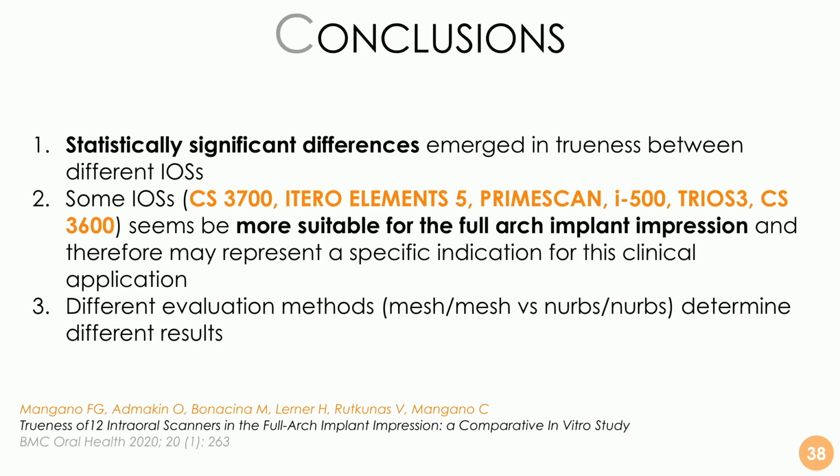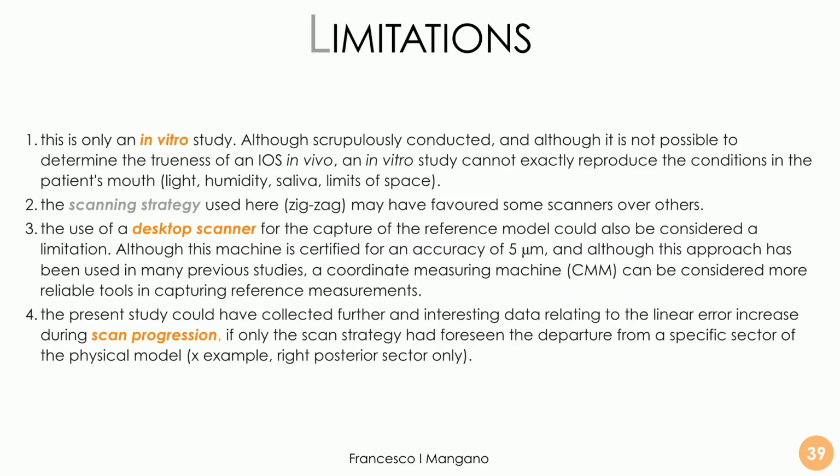Obviously, different evaluation methods determine different results, and there are also intrinsic limits in this study. It's an in vitro study, but of course we cannot perform any in vivo study for the trueness, because it's quite tricky to introduce a reference object inside the mouth. Maybe the scanning strategy used here may have favored some scanners over the others. The use of a desktop scanner can be a critical point, but in this case it's a scanner with a certified accuracy of less than 5 microns.